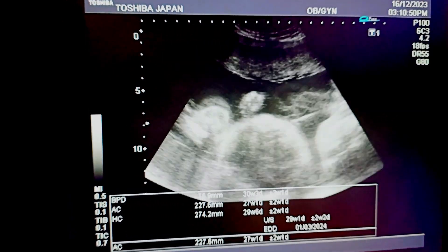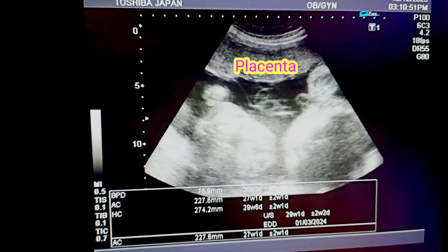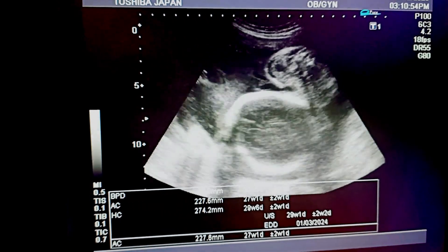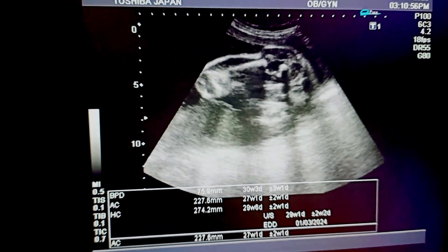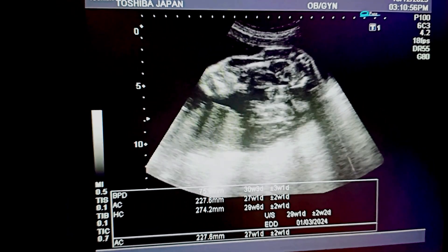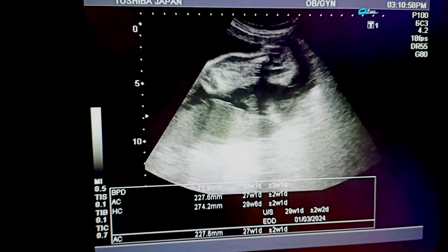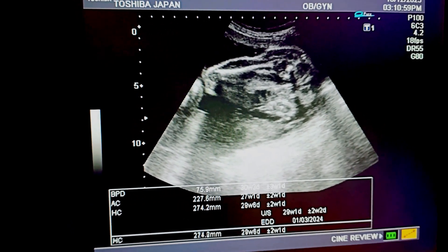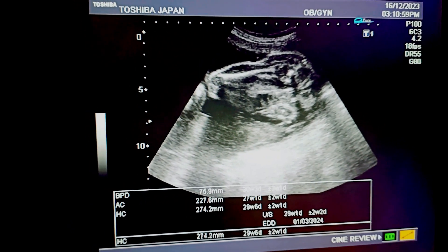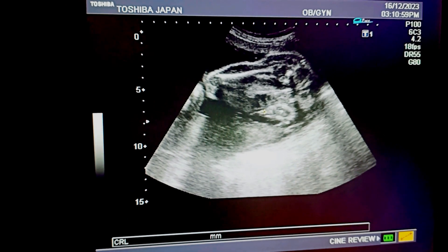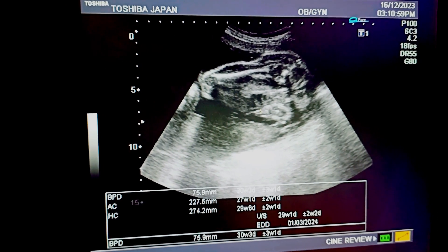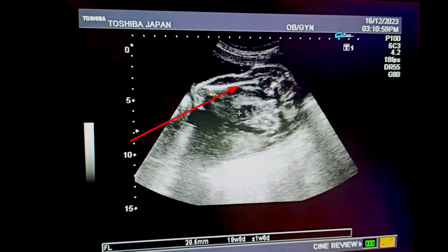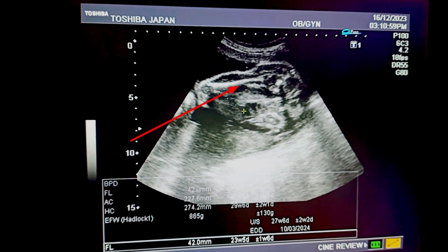You can see the backbone and placenta, which appear normal. This is the femur — we would like to calculate the femur length to find out the fetal weight, fetal age, and expected date of delivery.